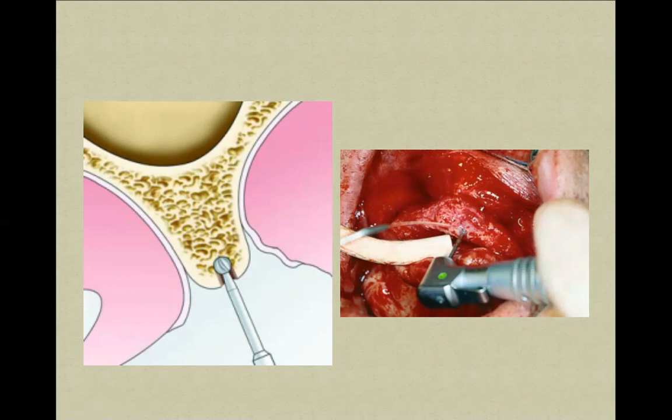But well, to tell you the truth, I don't like these things. I just like the knowledge of anatomy. I know where a canine should be located, or canine, premolars or molars. So I'm doing the first projection in the maxilla. If this is a totally edentulous maxilla, I'm gonna start from the canine, and I'm gonna go back.